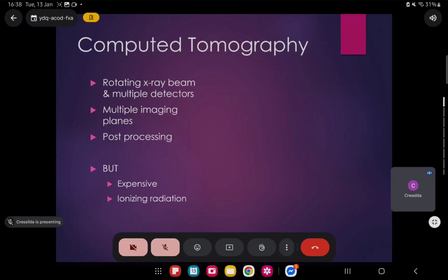So this CT scan is connected to a computer, which would then process lots and lots of data in order to produce beautiful images of diagnostic quality. CT scans can also be windowed in a way that will optimize the visibility of different types of pathology after they are obtained.